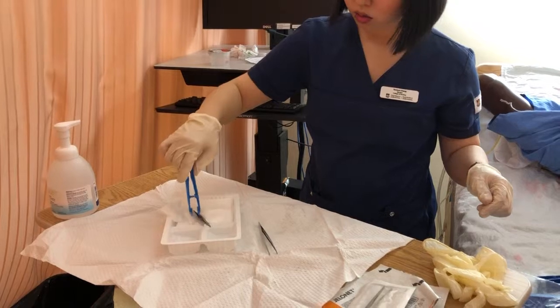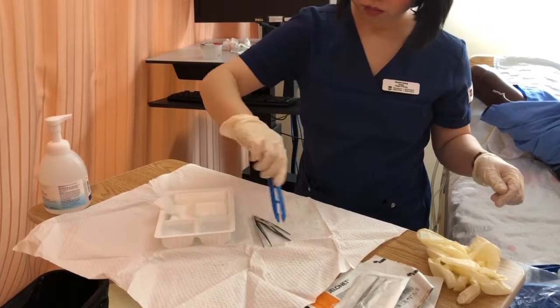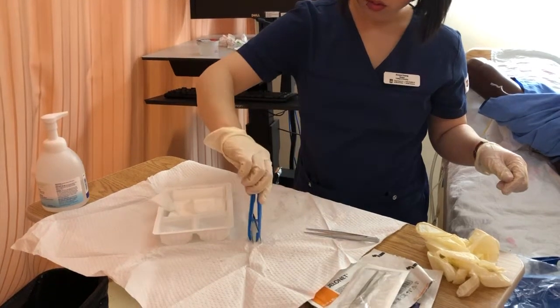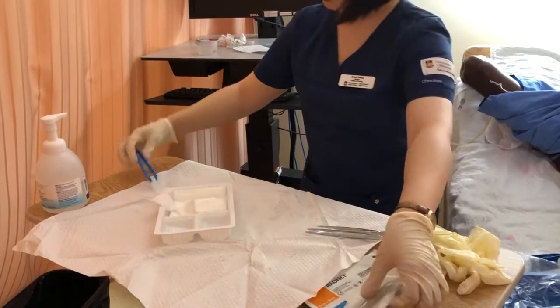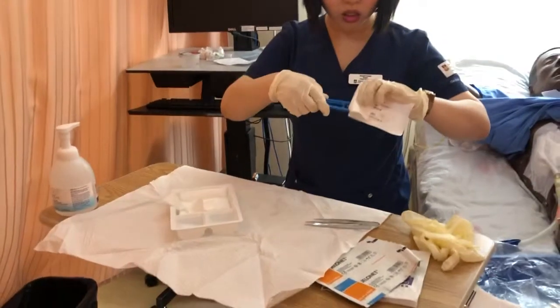Okay, so it looks like I'm missing the mepifix, so I'm going to go ahead and get it. And I'm going to take an extra forceps out just in case.